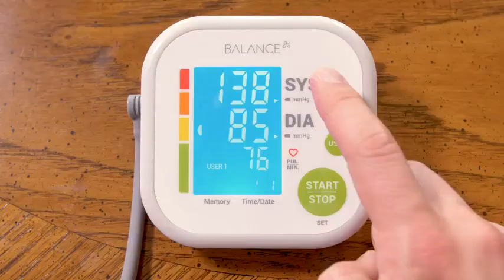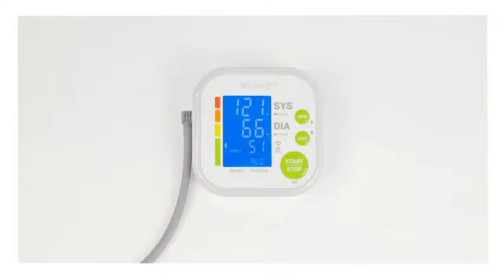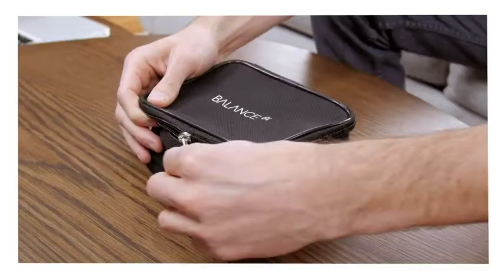And there you go. You've got your systolic, your diastolic, and then your heart rate right down here at the bottom. At the very bottom you'll see it's got a time and date. It will store 60 entries within the unit itself, and it will even give you an average of your last three entries.